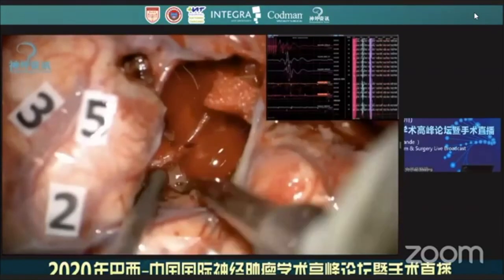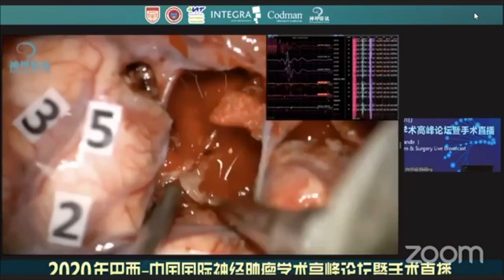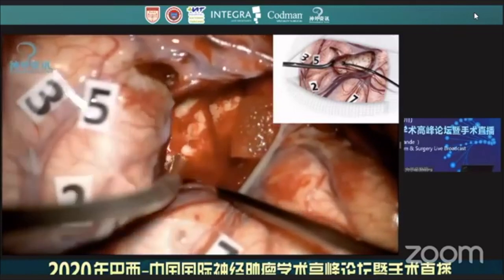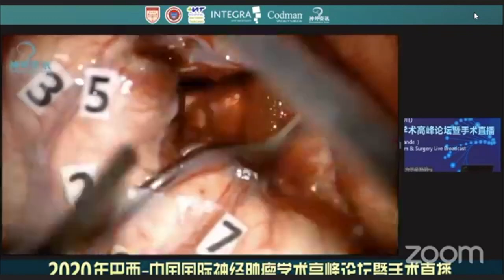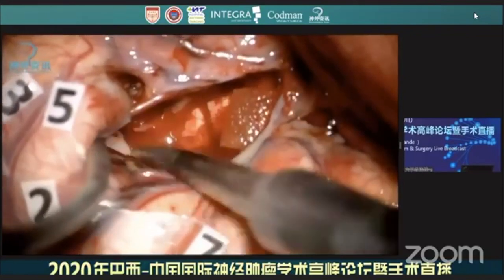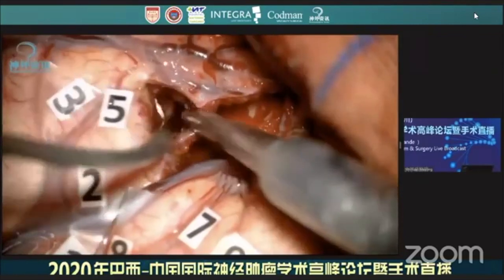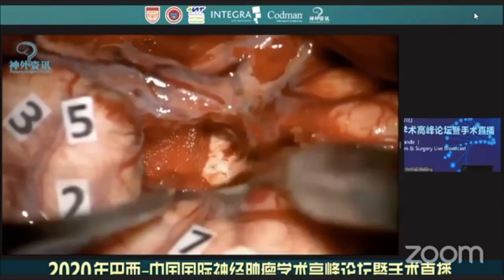Subcortical stimulation was performed to identify language pathways using a monopolar probe. The uncinate fasciculus and the inferior frontal occipital fasciculus all course at the same depths under the inferior limiting sulcus. The lateral lenticulostriate arteries, which supply the internal capsule, putamen, and globus pallidus, should be spared. Electrocoagulation should be avoided if possible. Continuous language and motor subcortical mapping for identification of the internal capsule and corticospinal tract during resection of zone 4 tumors is very important.